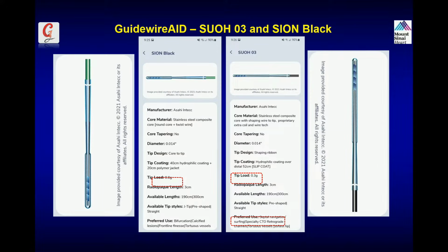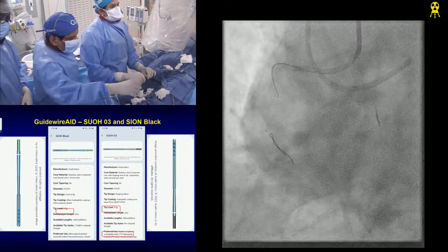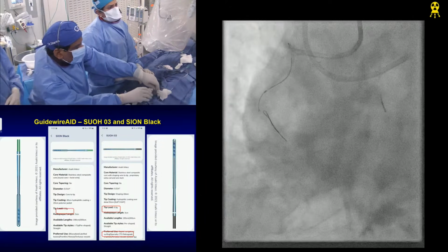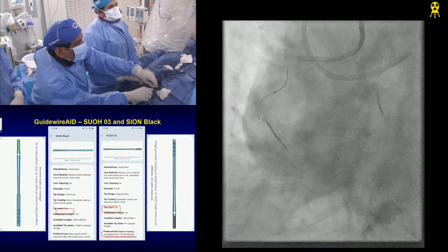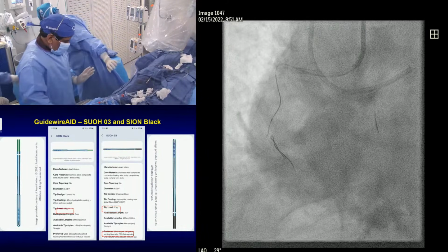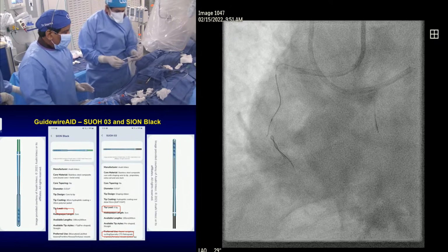It's going outside. You see that? Okay, a starter is there. You may destroy it. Okay. Don't touch it. What do you need now? Okay, the last wire of the day.